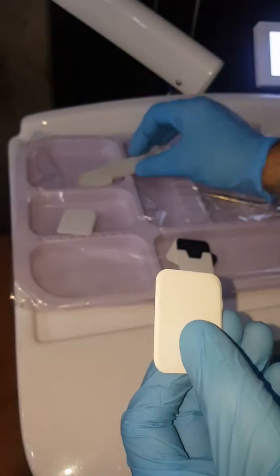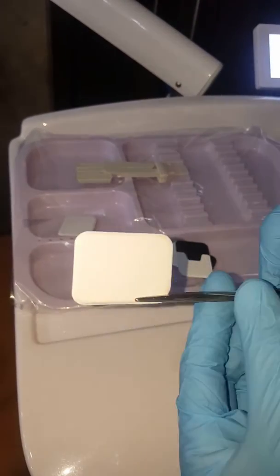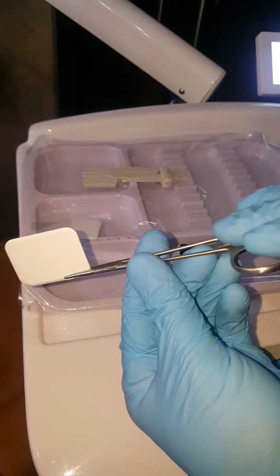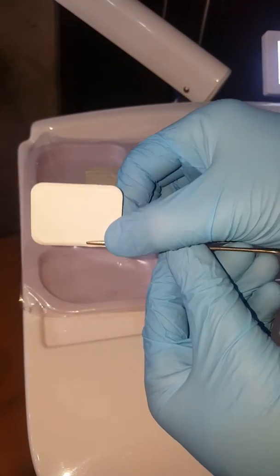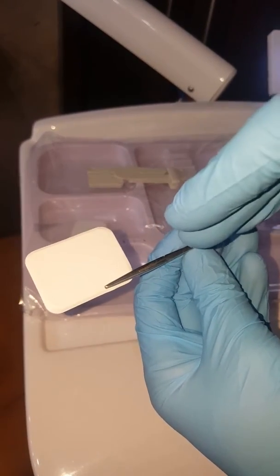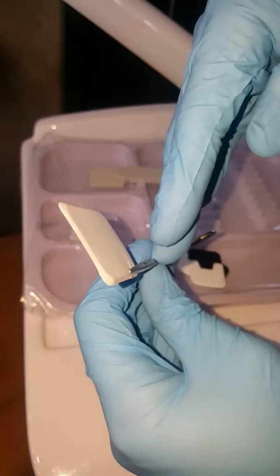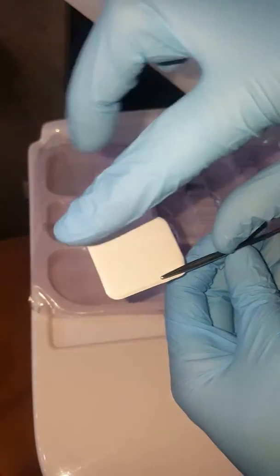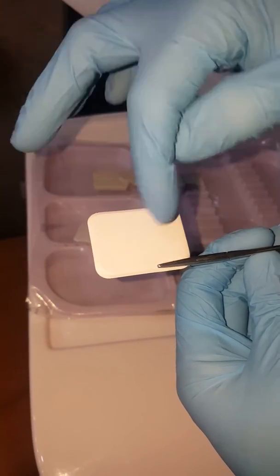A lot of people don't have this film holder, so what I recommend is using a hemostat. Using an instrument like this gives you the angulation of the film. When the film is placed in the mouth and the patient bites down, it positions the film right in the back. You can look at this angle of the holder to align your cone to make sure you're angling properly. If you need to bisect, you angle the cone like this. If you need to take a straight picture, the cone goes straight at it. From this you can also approximate where the film is, so the cone does not give you a cone cut in the top, bottom, or anywhere.